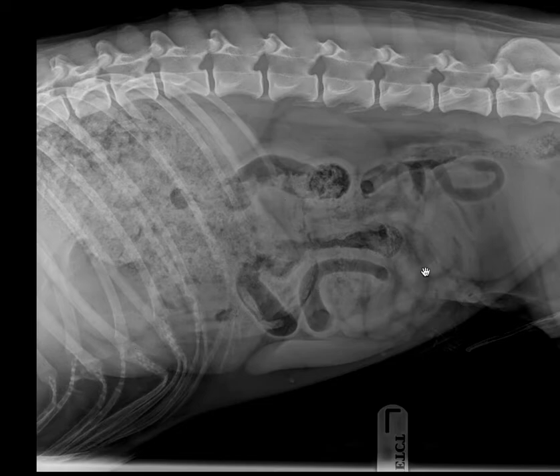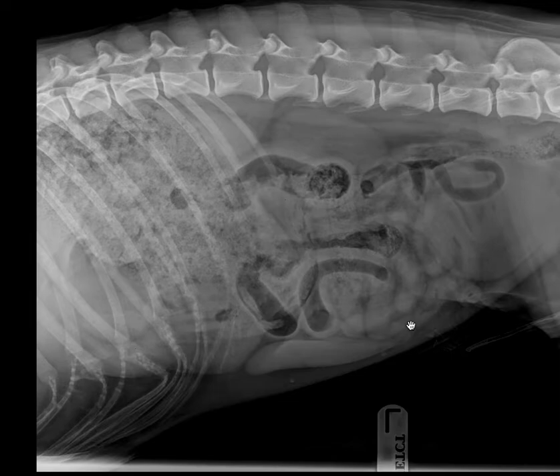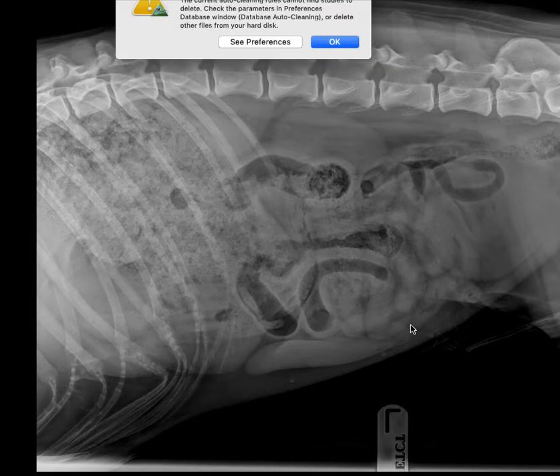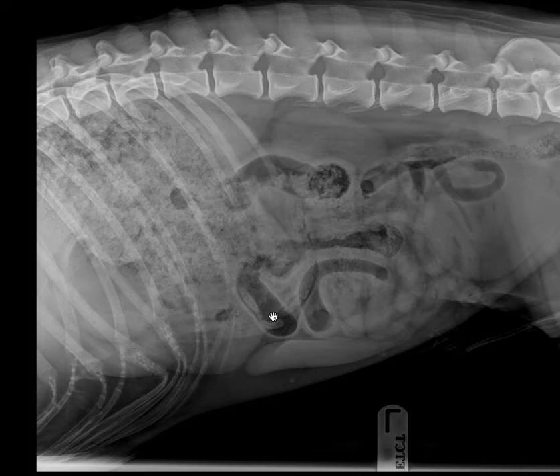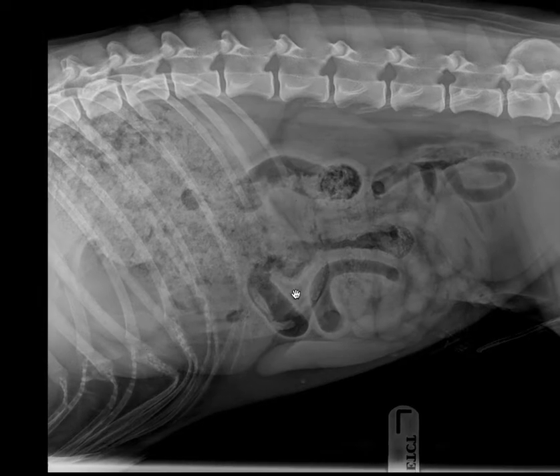My overall impression is that the intestine that I do see is not overly enlarged. Therefore, I would conclude that the gastric contents are abnormal. Clinical correlation is required to determine if this is more likely to represent foreign material or delayed gastric emptying of normal ingesta. Remember, if delayed gastric emptying of normal ingesta, that does not rule out foreign material, because foreign material — for example, in the duodenum — could contribute to delayed gastric emptying.